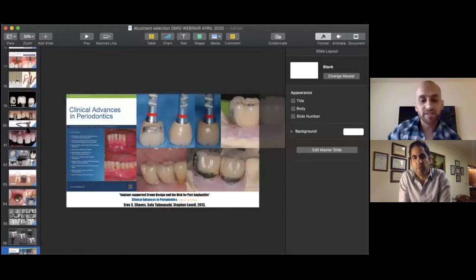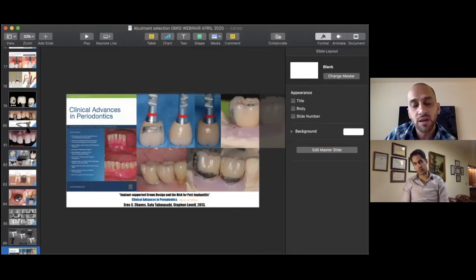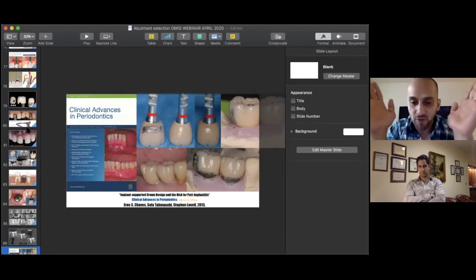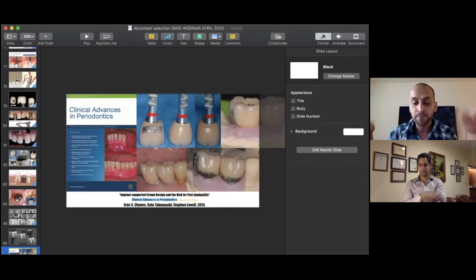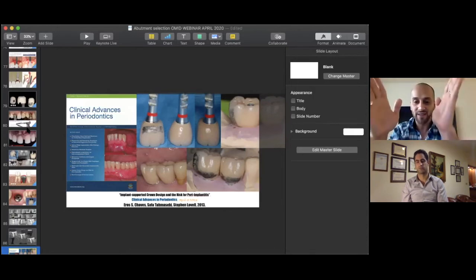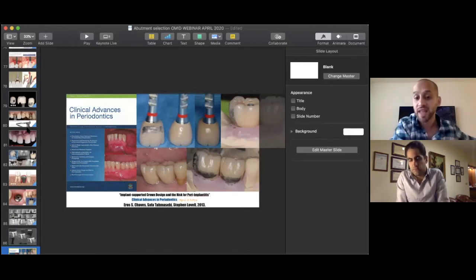So let's talk about healed ridges for a moment. One of the ways that I personally do it, and obviously some people may disagree with this, is that when I place an implant in a healed ridge, especially in the posterior area, I use very wide healing abutments, the widest that I can. If I'm platform switching, great. But I'm against using these very small diameter healing abutments. So when the patient heals after 2-3 months, that emergence profile has already been done for me. Maybe I should make a slide about that, because there are implant companies that have healing abutments that come out of the bone and then converge correctly, and then they have impression copings that have the exact same profile, and abutments that have the exact same profile. So you could actually build up to that from the very early stage of implant placement.